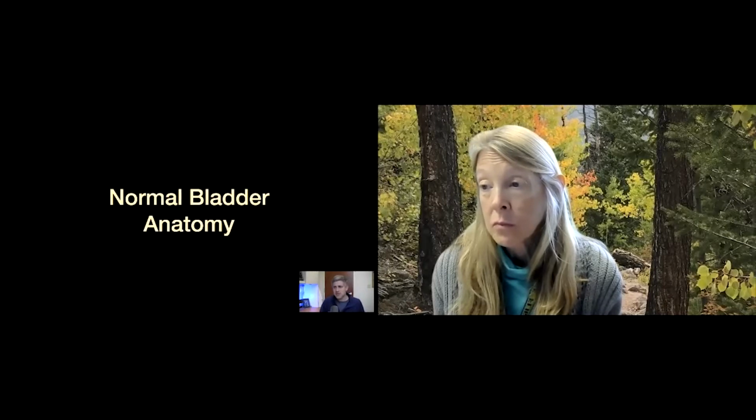As we get started, let's chat a little bit about bladder anatomy, or at least normal bladder anatomy, right? And as you can tell, it's a water balloon. That's it, right? It's a balloon. Now, I've basically offended every single urologist and nephrologist out there who's watching this.